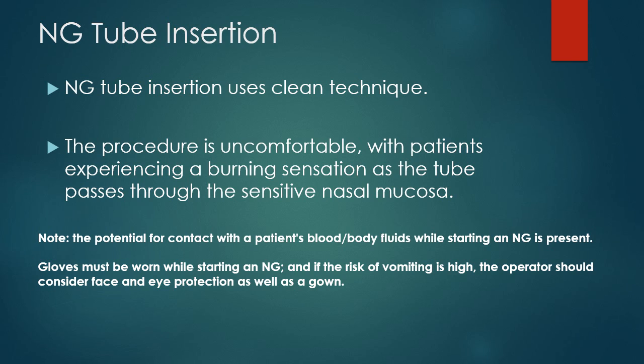The insertion is a clean technique because you're inserting the tube through the nasal passage into the back of the throat or the oropharynx, down into the esophagus, and then into the stomach. So this area is not a sterile area.